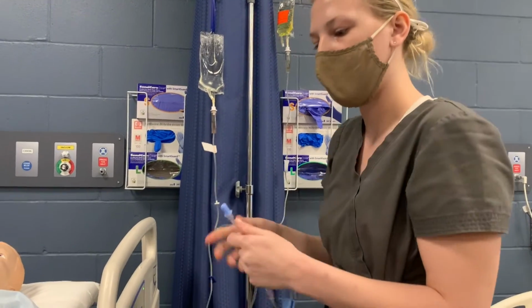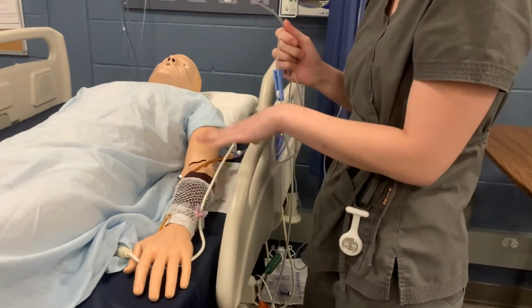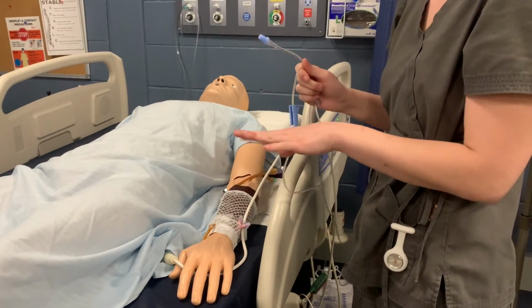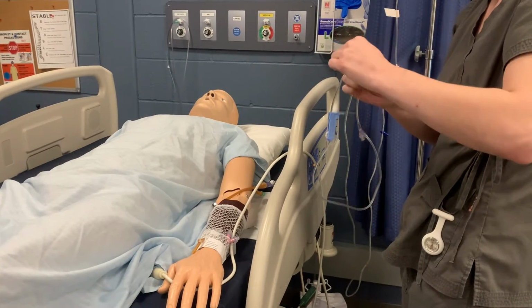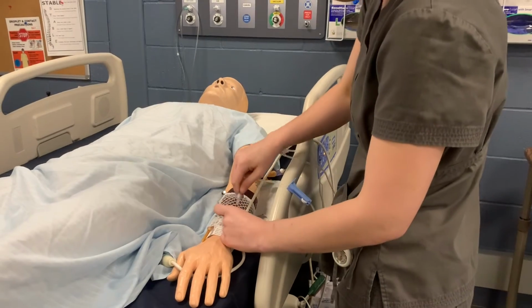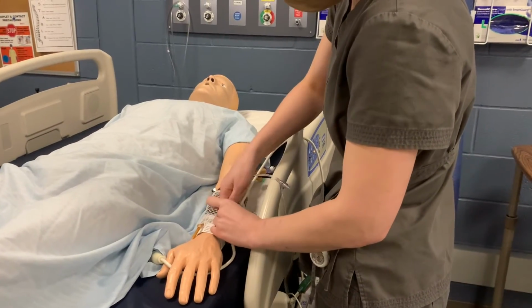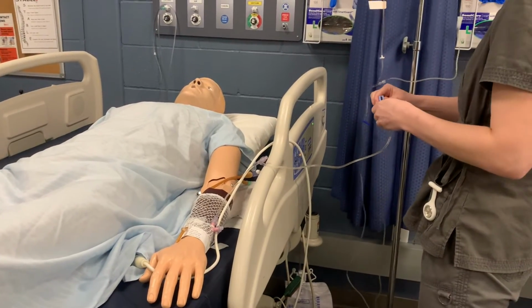And when I was flushing his lock, I was checking his IV site to see if there was any swelling or redness or anything that told me that I should not be continuing to put anything else in this IV. So I'm going to go ahead and take this cap off, connect this, lock that in place, and then I can go ahead and start opening some of my doors here.